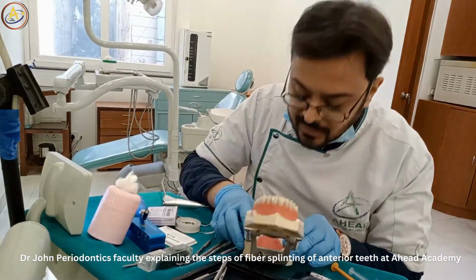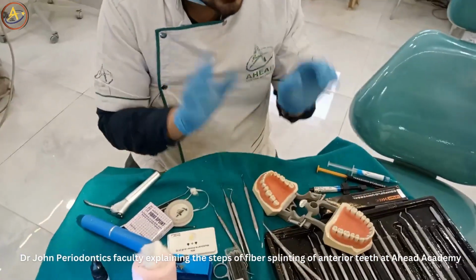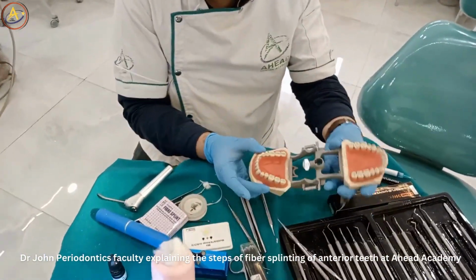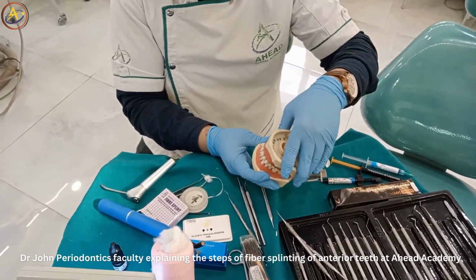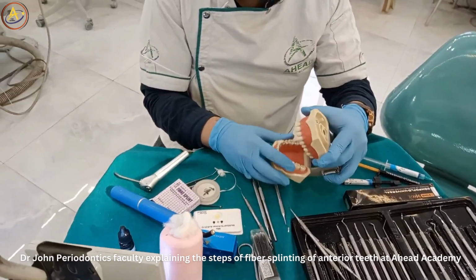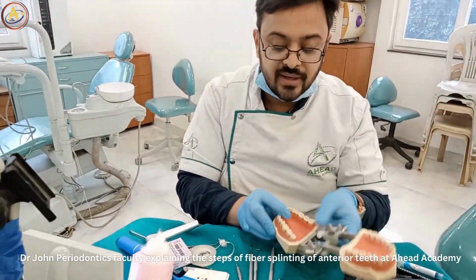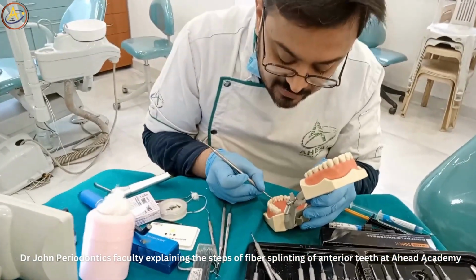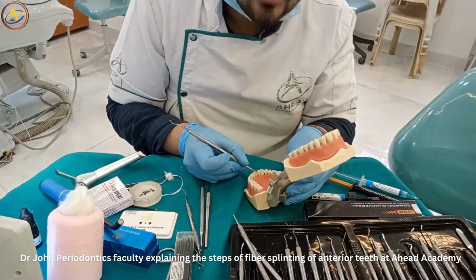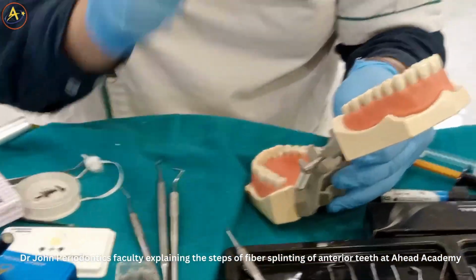Okay. So now you see it is perfectly cured. Now for example, he is a patient. So what will we tell him? We'll tell him to close the mouth. We'll check for the occlusal contacts. You will take articulating paper and you keep it here and you will check whether there are some occlusal contacts. If there is no contact, then what will you check? You will take your gloved finger and check whether there is some high point or thickness which the patient can have a problem with in the future.